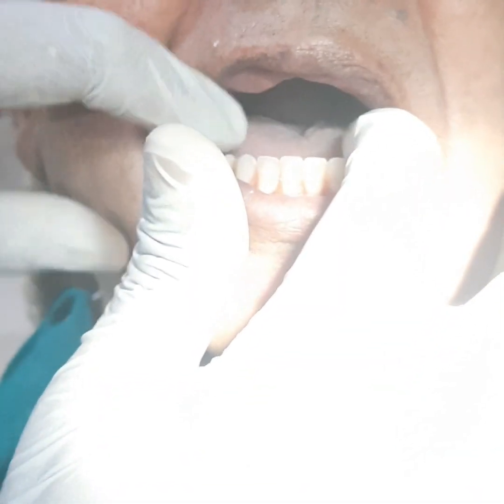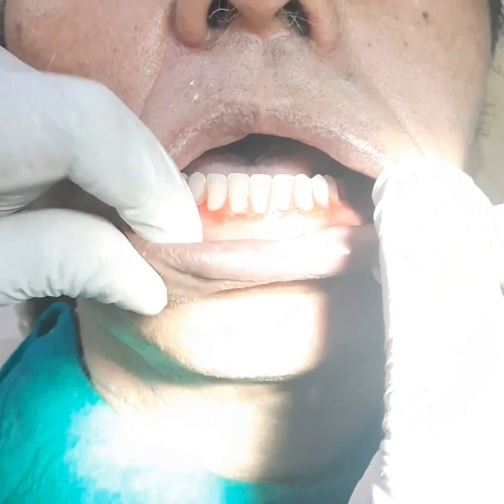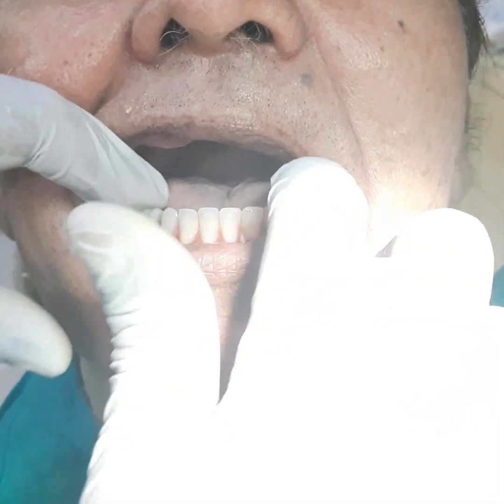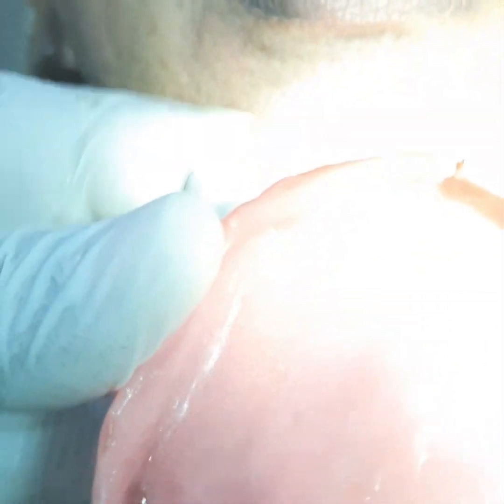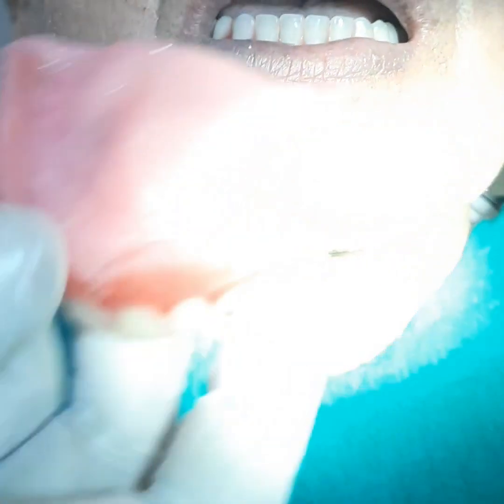Once it is seated into position, you are going to check if there is any interference at the freni region and you are going to relieve that. Likewise, you are going to take the maxillary denture, examine the maxillary denture and its intaglio surface, and then you are going to place it into the patient's mouth.